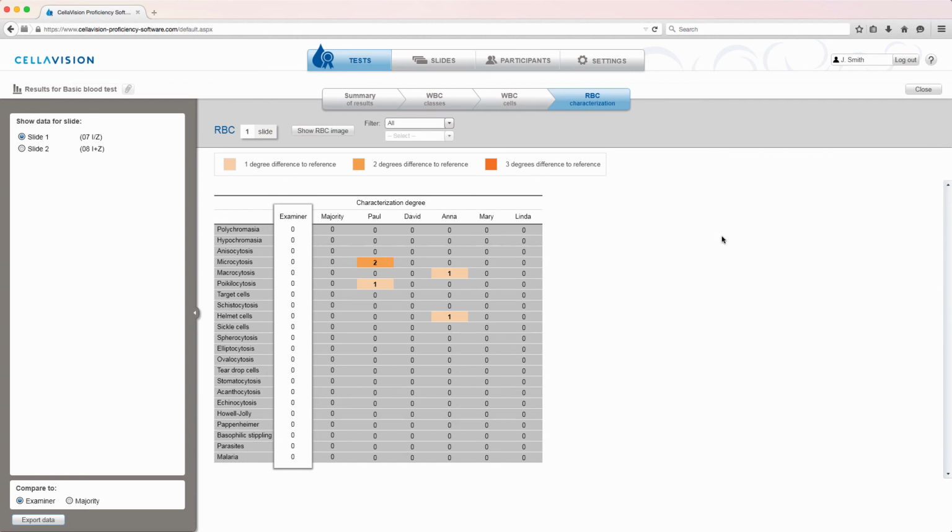We have now gone through the different levels of the results and learned how to interpret them. In the next tutorial, we show how to take a proficiency test if you are a test participant.